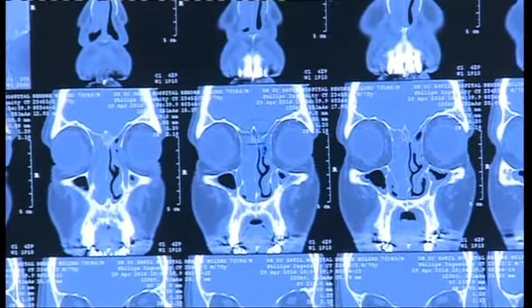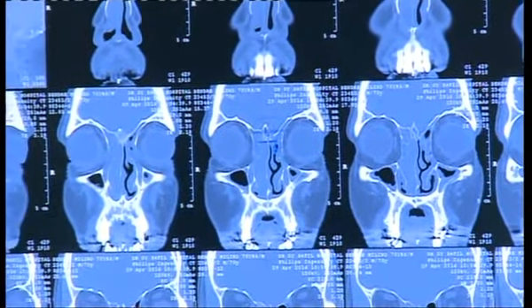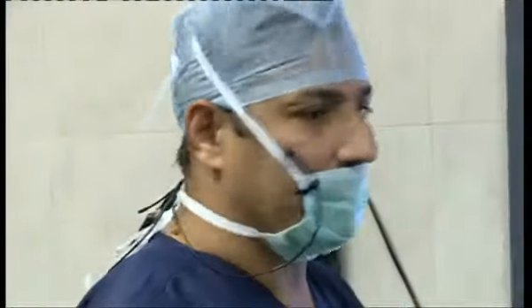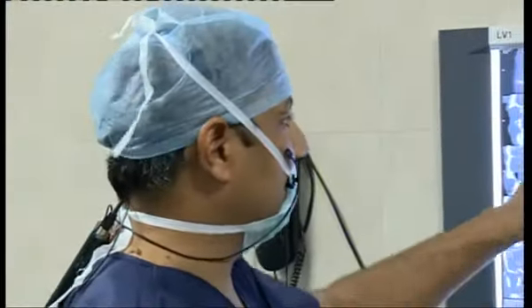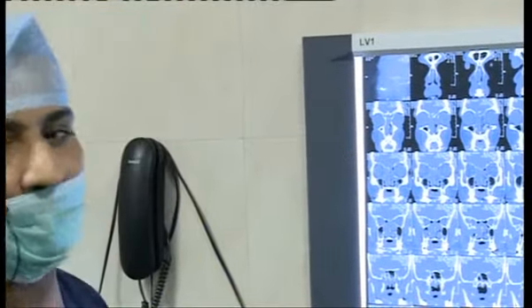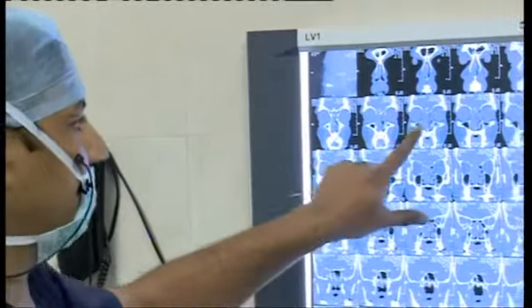And secondly, the thickness of the uncinate varies. If there is too extensive disease, that might be a thin plate. You can remove it by any means and don't even appreciate what you have done. So that can go unnoticed. But it depends, you need to be careful. Once you ask how it is to be done, it should be like that.